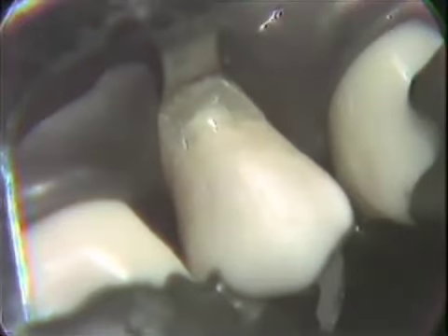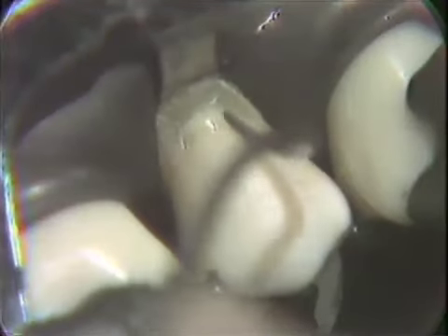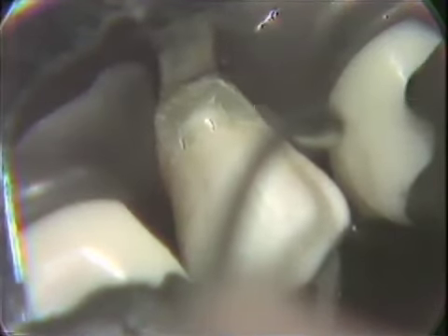We've now completed the smoothing of the margins of the preparation. We have also applied cavity varnish to the prepared cavity and removed varnish from the margins of the preparation. We'll do this with the cohesive gold because of the possibility of contamination and the folding of any of the varnish at those margins, creating a thickness of that material that would be detrimental.